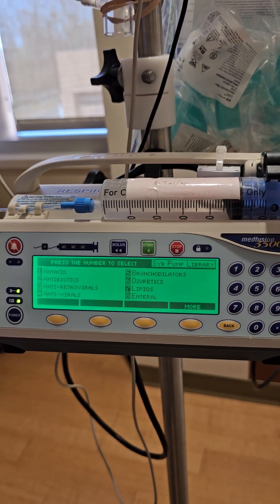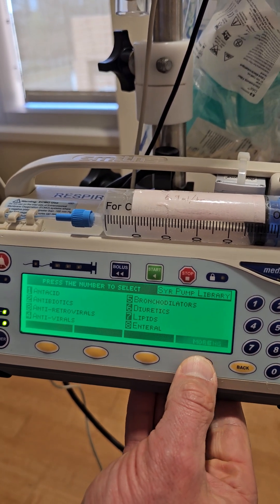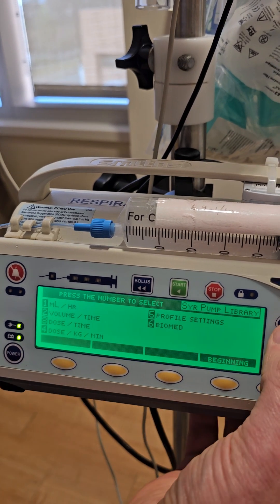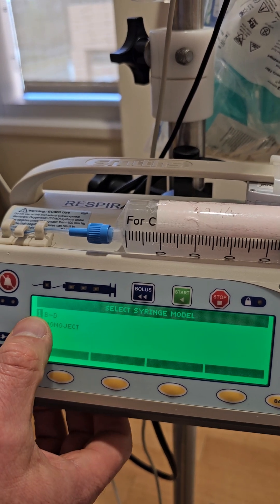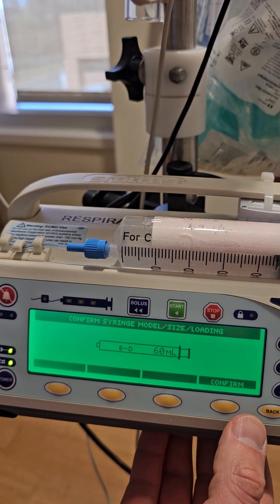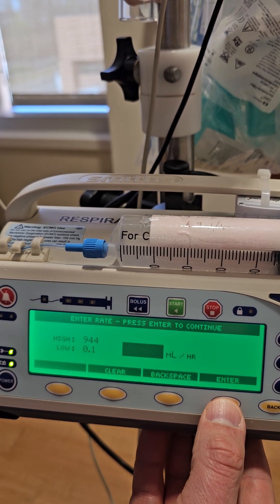Now we're at the startup menu and we're going to go straight to 'More' right here. We want milliliters per hour, so we're going to select one for milliliters per hour. Confirm that selection by saying yes. We want BD, so we'll select one. We'll confirm we have a 60 mL syringe.